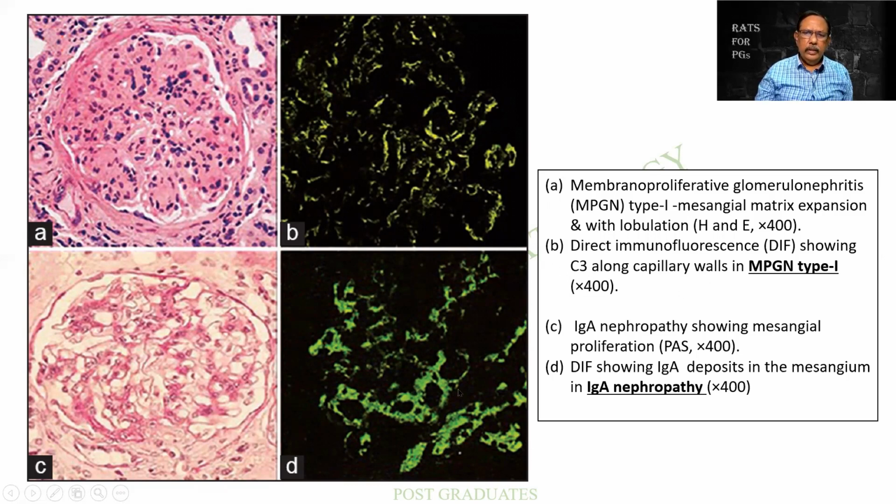This is an IgA nephropathy which is showing again mesangial proliferation, which is eosinophilic. The darker ones are the capillary walls, and there can be deposition of IgA, so it can be called IgA nephropathy itself. So look at the various usages. The difference in the pictures also you can appreciate. Therefore, a person who is versatile in this will be able to identify. But generally it is advised that light microscopy, electron microscopy, then PAS and the silver stains along with immunofluorescence are mandatory in the interpretation of the renal biopsies, which I hope we shall be seeing some other day if time permits.